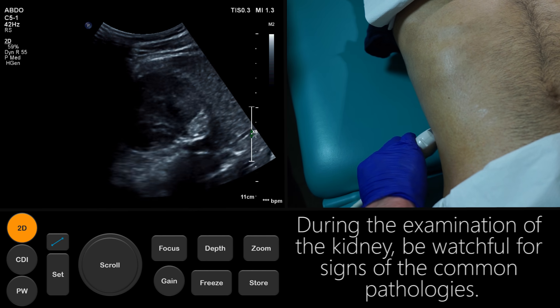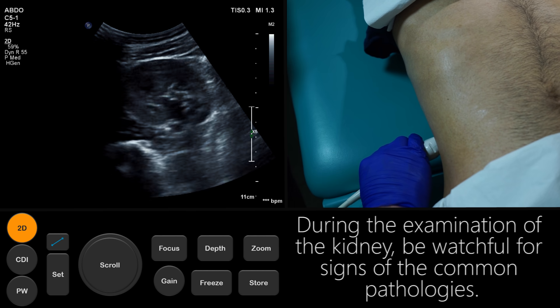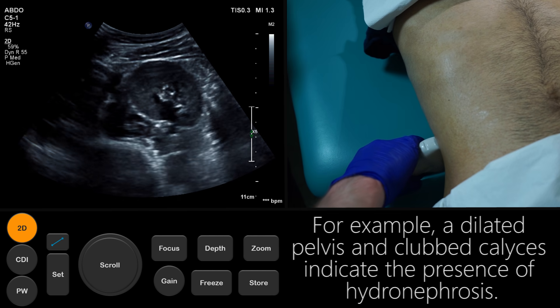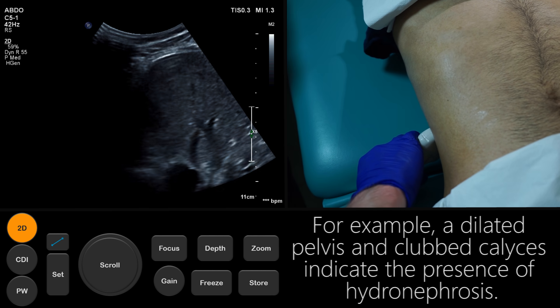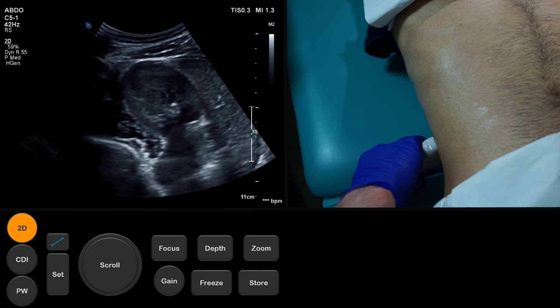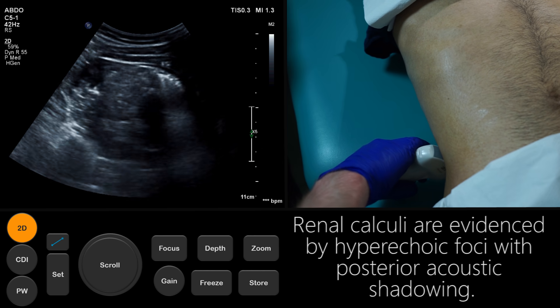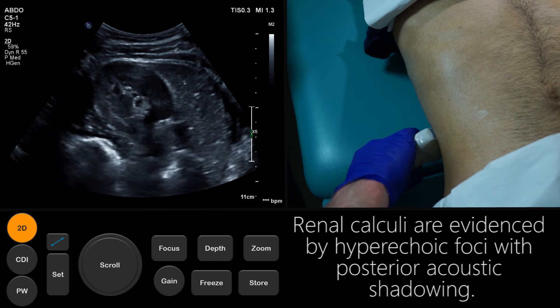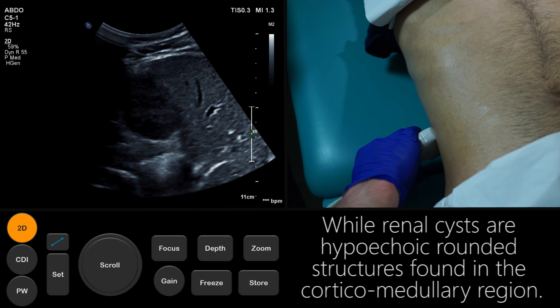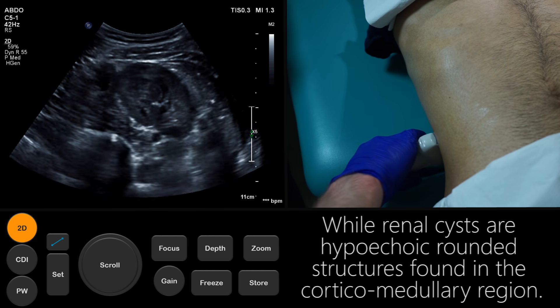During the examination of the kidney, be watchful for signs of the common pathologies. For example, a dilated pelvis and clubbed calyces indicate the presence of hydronephrosis. Renal calculi are evidenced by hyperechoic foci with posterior acoustic shadowing, while renal cysts are hypoechoic rounded structures found in the corticomedullary region.